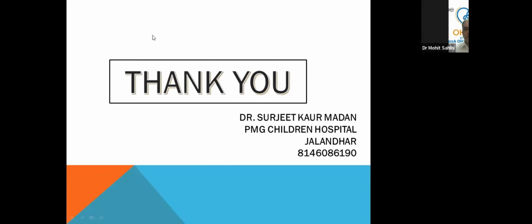Dr. Jamal wants to see, can you show the RDS features once more? Yeah, sure.